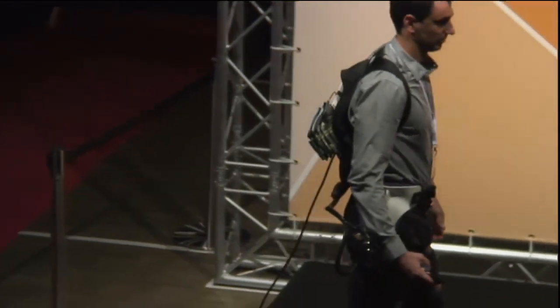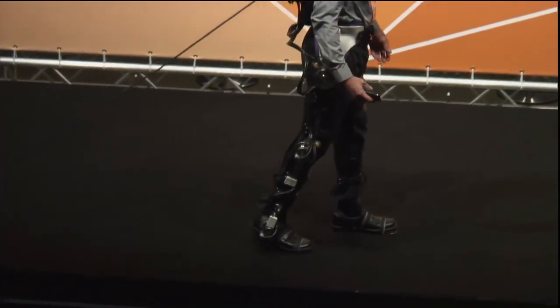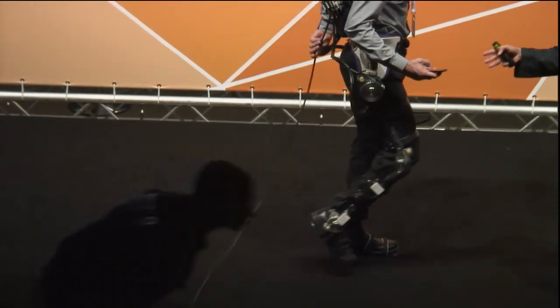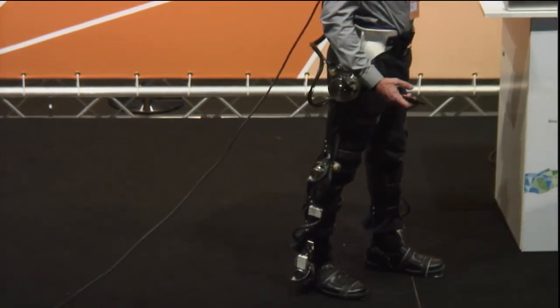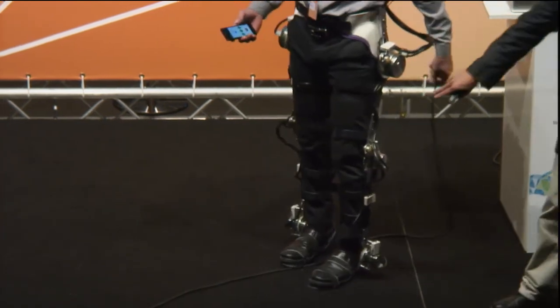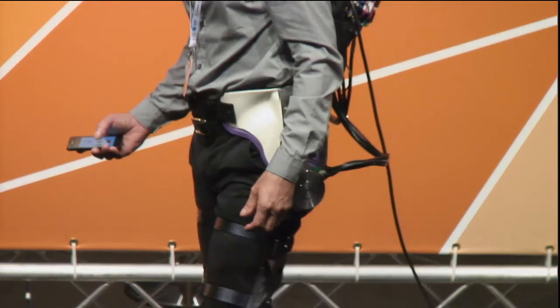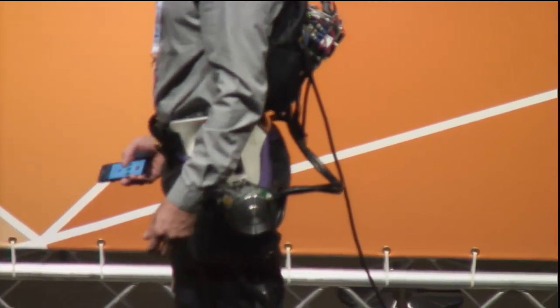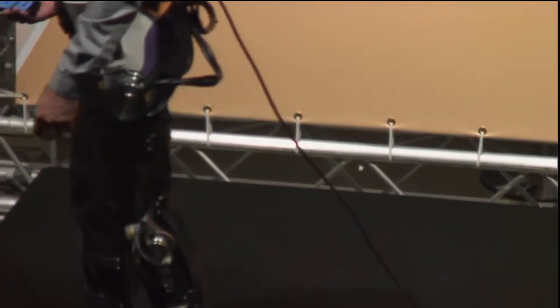Ideally, this would be used in combination with other technologies. Now we have only the system that will apply force to MAGDO's limbs. So now the system is driving his legs. Ideally, we'll have, for instance, a brain-computer interface that will be used to detect the intention of the user to start motion or to change gait speed. Or we can use, in combination with this, the electrodes, both for stimulation and for recording EMG activity. If we use the electrodes for recording EMG activity, we will estimate the level of fatigue of the muscles, and then we will use either the exoskeleton or the functional electrical stimulation system. So the idea is that with the combination of both systems, we just assist the user as needed.